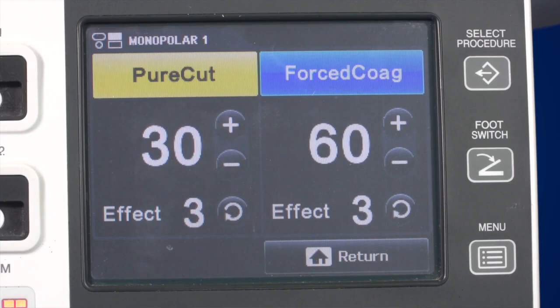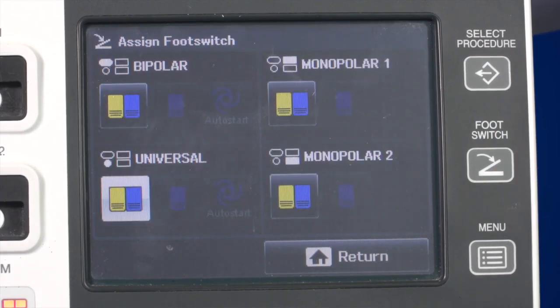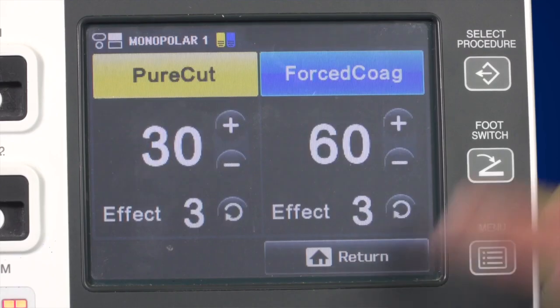Next to the display, there's a button labelled foot switch. Use this button to open the screen that allows you to assign the foot switch to a dedicated connection area. Once you've assigned the foot switch, it'll be displayed on the screen corresponding to the connection area.